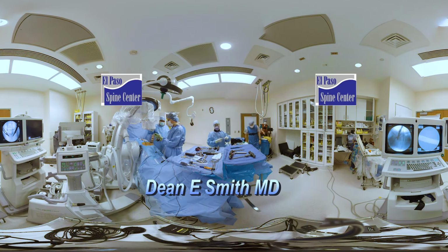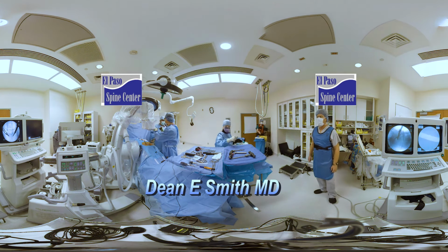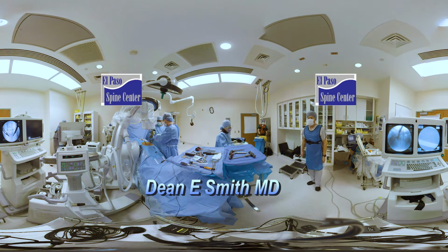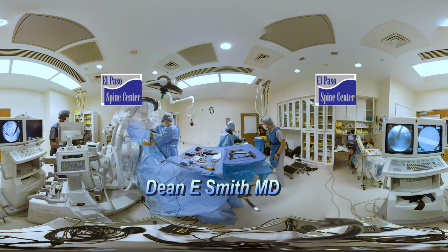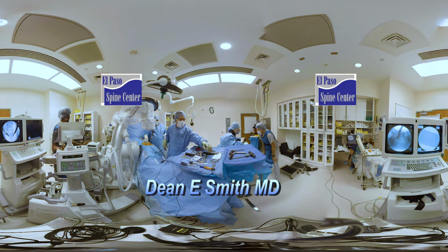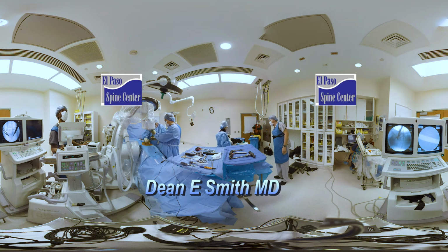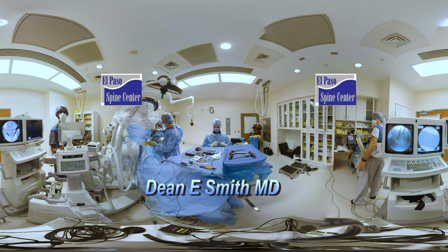That looks good though, right there, I think. Exactly. Okay. Let's see, do we have another hemostat maybe? I gotta get in there somehow. Okay, lateral. AP. I like it.